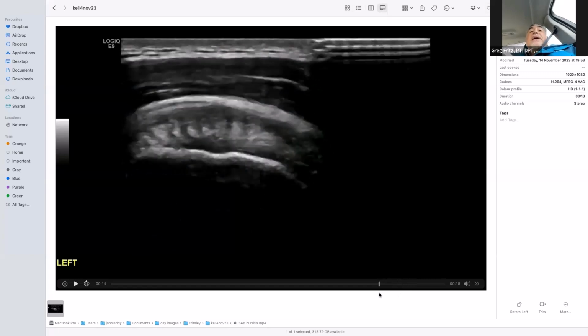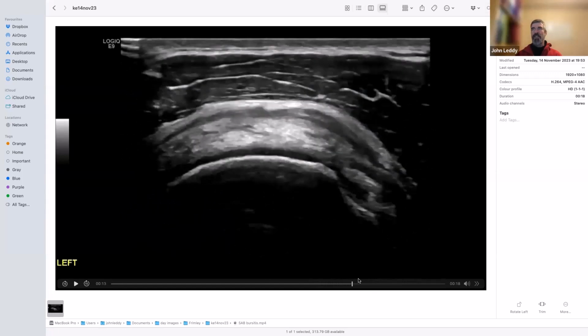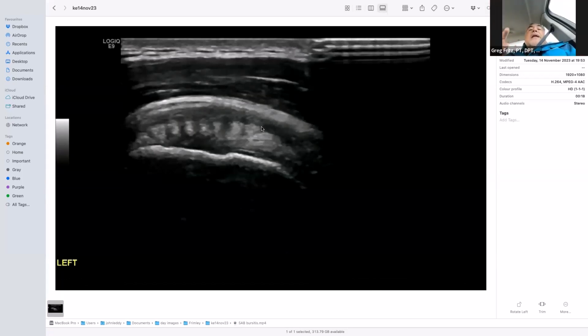I think you'd have to take it on an individual basis, but you see this ribbing there, and it might be muscle coming up in between, or it could be a little bit of edema that's tracking along the septations within there, because you get this appearance when there is some background inflammation or background tendinosis. But what it's not is supraspinatus going into it.